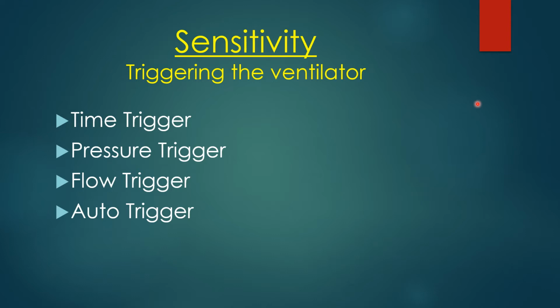When it shows the patient is triggering and the patient is paralyzed with neuromuscular blocking agents, that means one of two things. One, the drugs are wearing off and he's starting to breathe, or the machine is auto-triggering. So it's not always real obvious it's auto-trigger. You need to look for that and always be aware that could be happening.